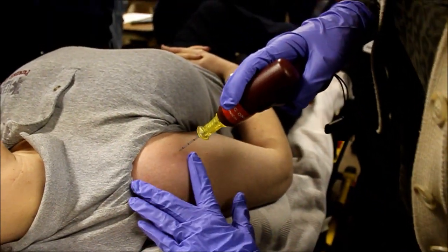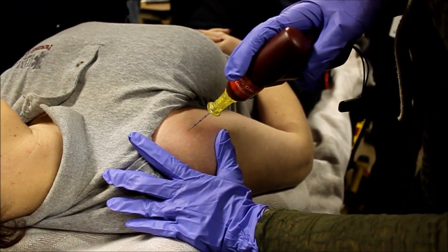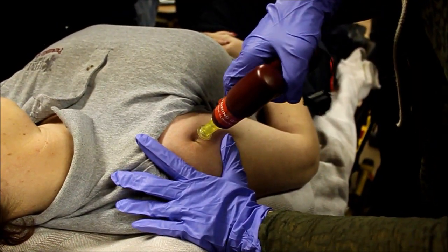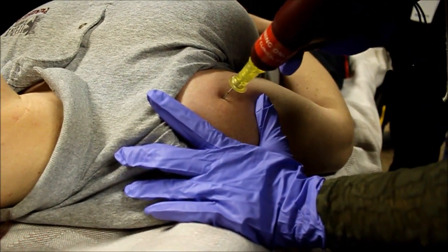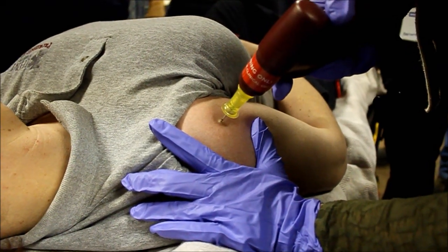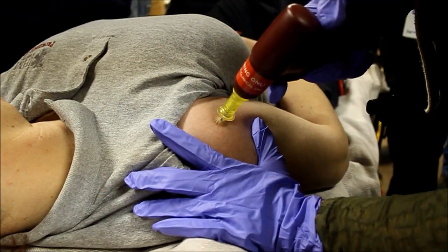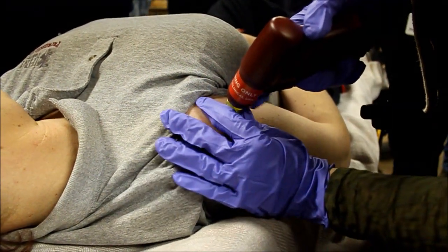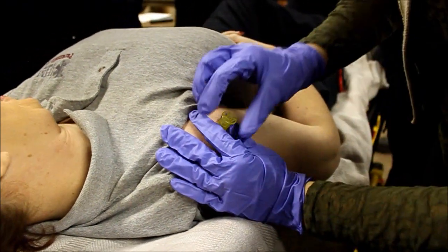Going through the skin is the hurt part. On three. Go through the skin first — you don't have to drill, just twist through the skin. A little poke. You hit bone. Now make sure you're perpendicular to the skin, then pull the trigger, keep holding the trigger, and just advance it gently until you're flush with the skin. Let the drill do the work. You're done. Now hold the hub, pull the driver away. Stabilize the hub and remove the stylus.